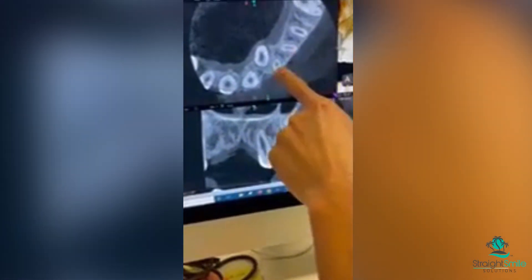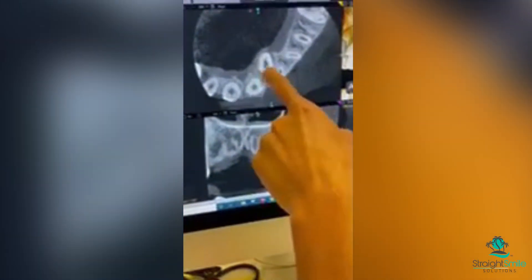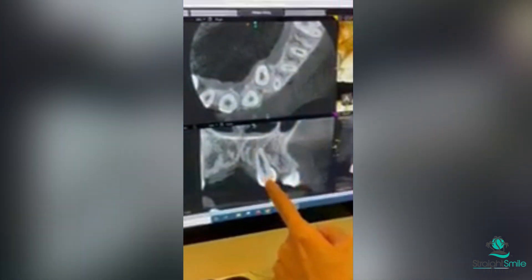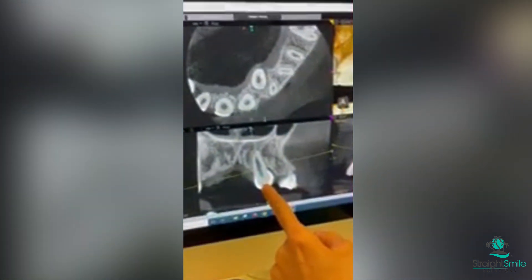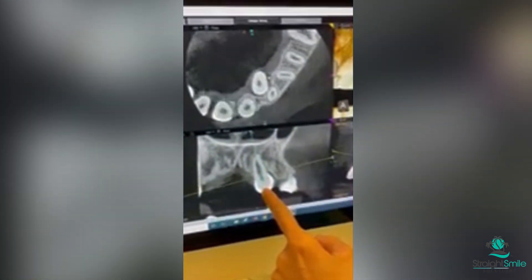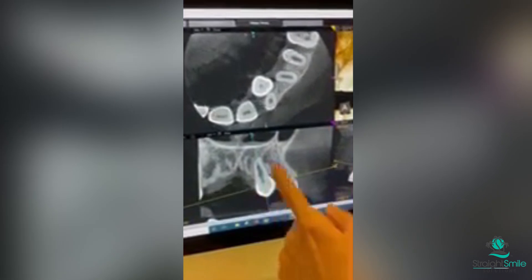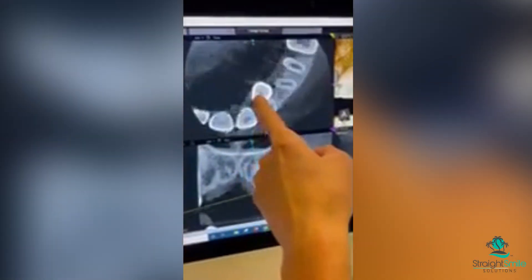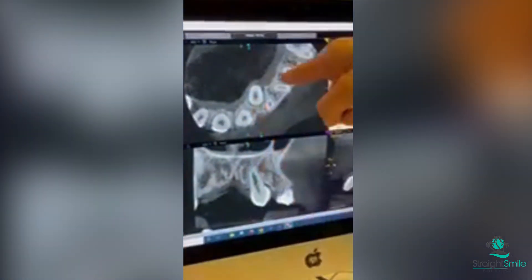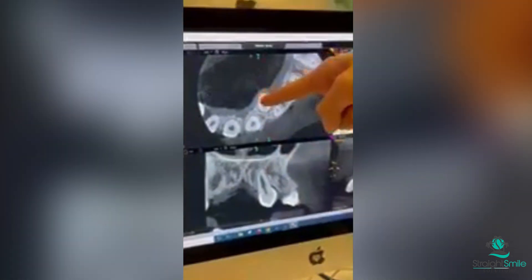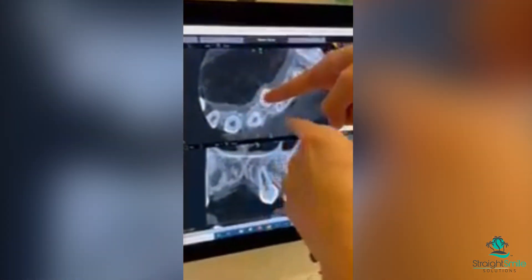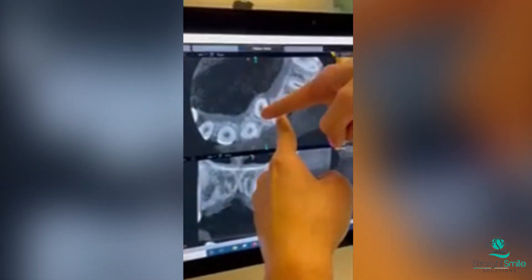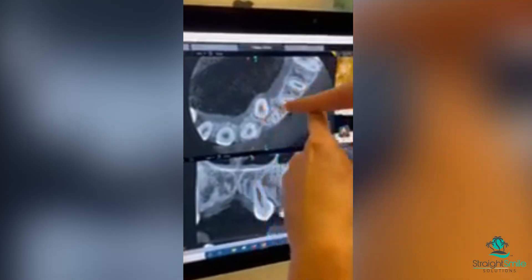Here's number 10 root, number 11. This is number 11 here, so if we go through this route, you can kind of see — 11 is very palatal in the position. So the root is going medial palatal; the root on 10 is distal palatal. So they're kind of criss-crossed like this.